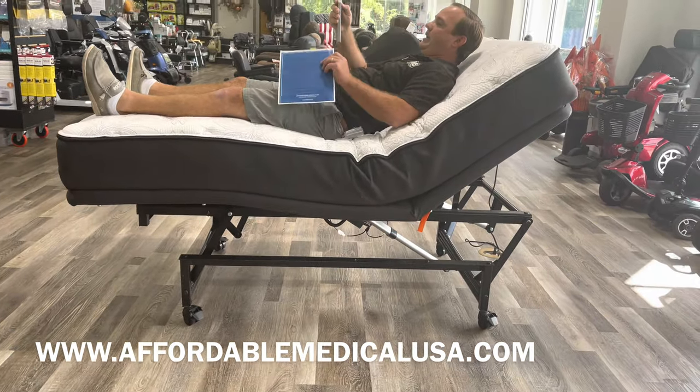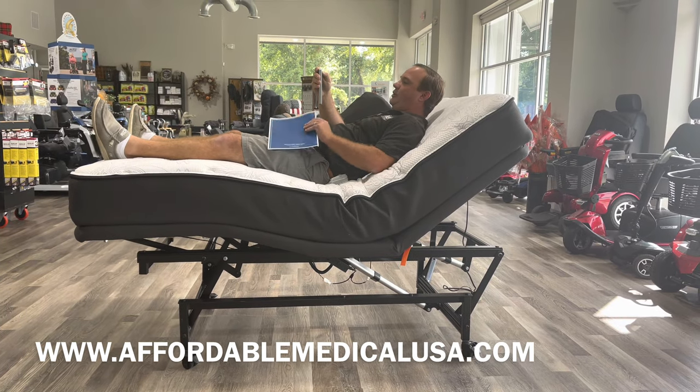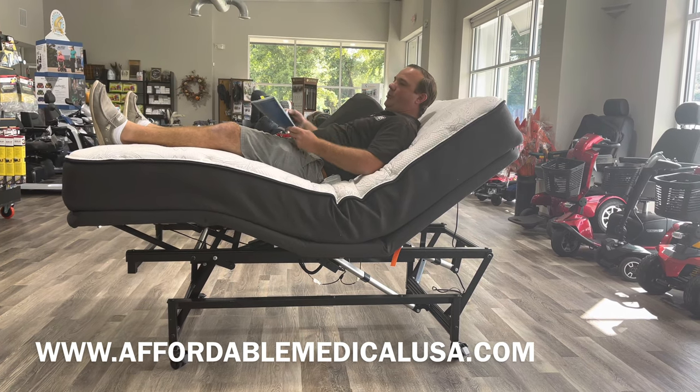This bed is made in Lafayette, Georgia, so it's American made. They're pretty quick at shipping. We can white glove deliver it, or we can drop ship it to you and it's pretty much all put together.